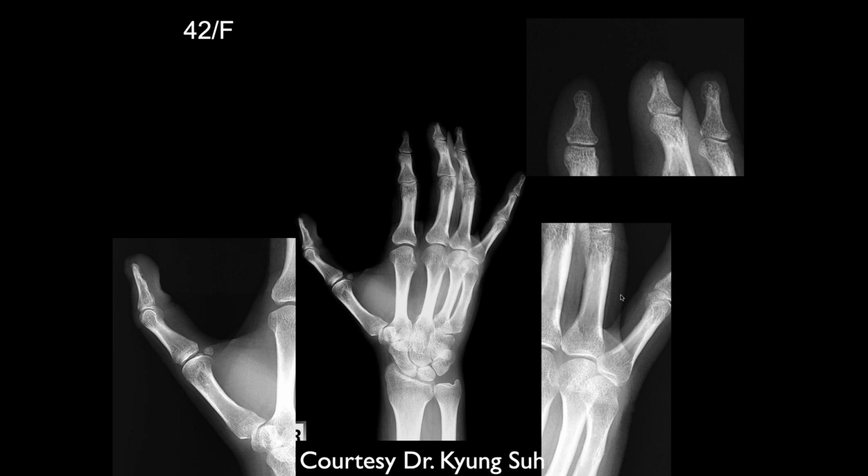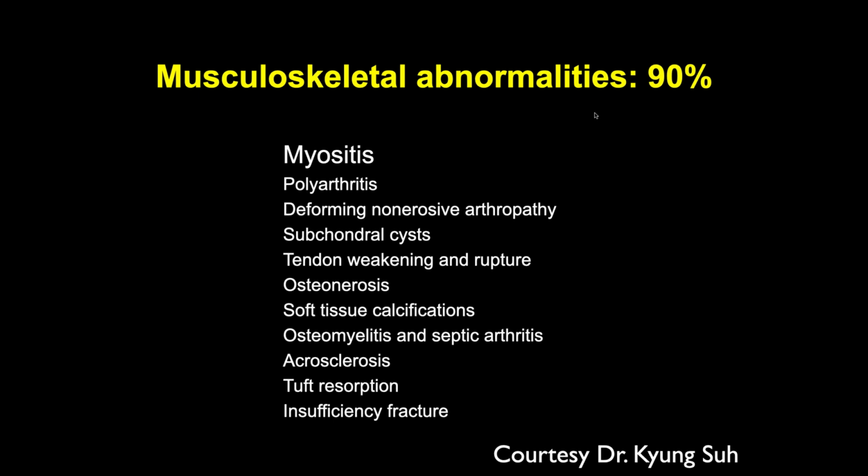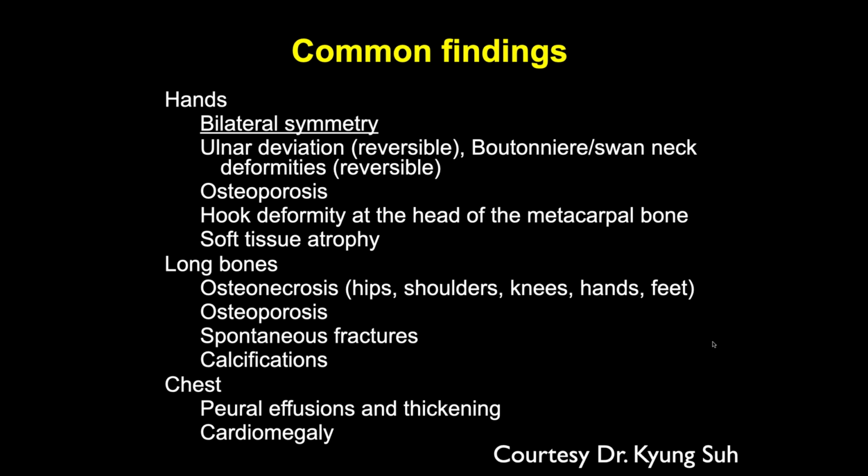This is a 42-year-old female. We can again see at the third distal phalanx, also the fourth distal phalanx, the tuft. I think there's another acrosteolysis here, some distal tuft resorption. Okay, so you can also see some ulnar deviation, and sclerosis along. Okay, this is a lupus case. Yeah, makes sense. So you can get a lot of abnormalities in lupus erythematosus. About 90% of these patients will have some sort of musculoskeletal manifestation, myositis being one of the most common. But you can get acrosteolysis and tuft resorption as part of it. Typically it's bilaterally symmetric, and you can get a lot of changes with long bones. One of the things that we commonly see in lupus is bone infarcts.